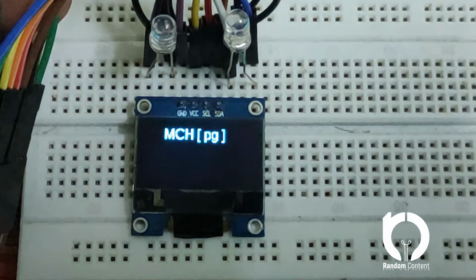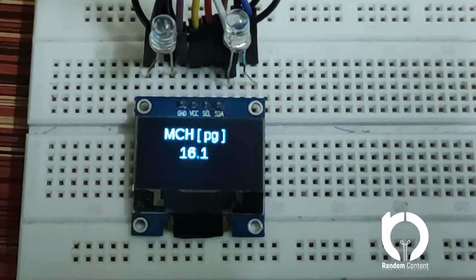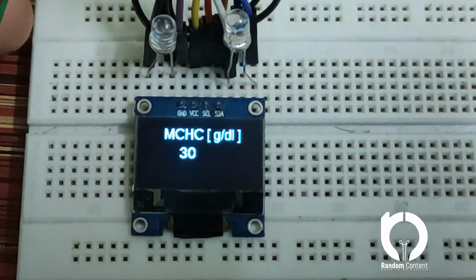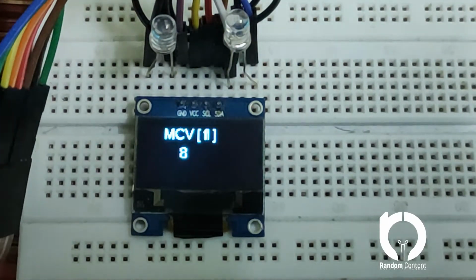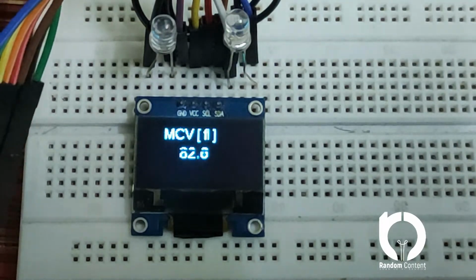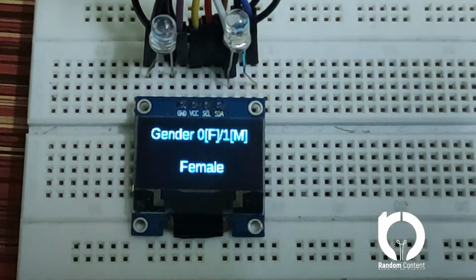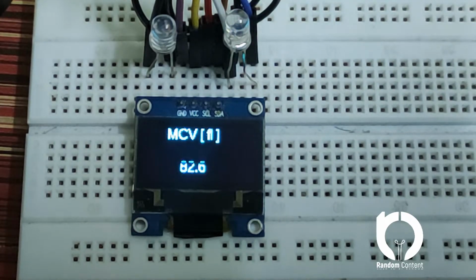11.2, and then 16.1. Now the MCHC value I'll use as 30.3, and MCV is mean corpuscle volume, which I'll give as 82.6. If I press A now, the values will go to the program. It will first show what values we had entered. MCHC and MCV value is 82.6.